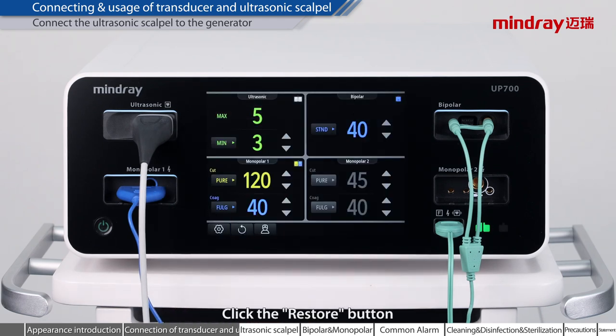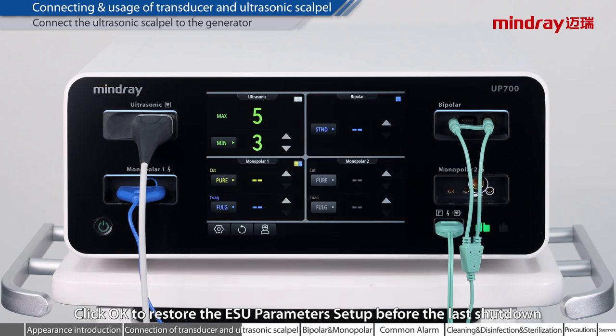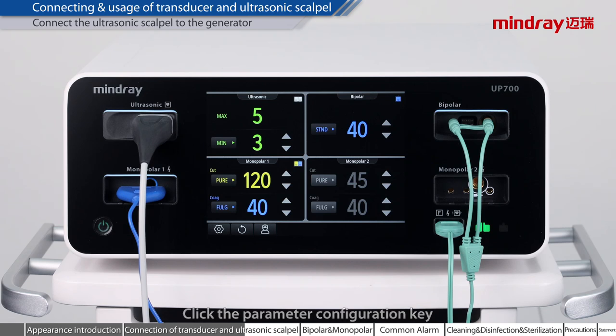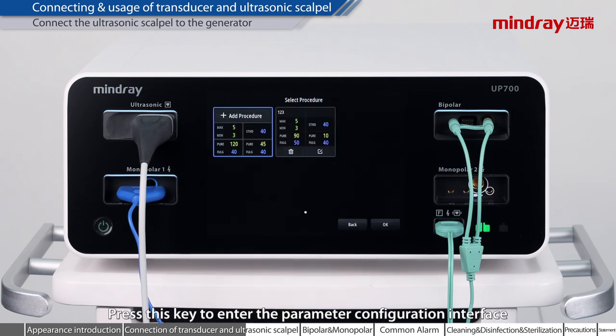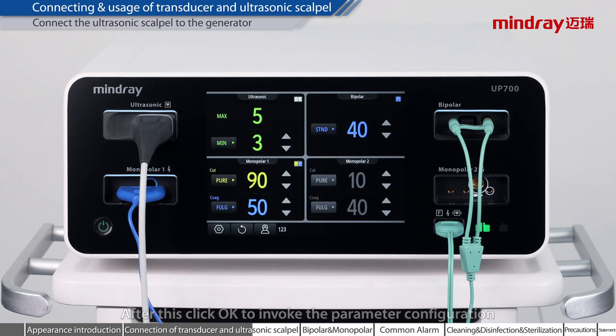Click the Restore button, then click OK to restore the ESU parameter setup before the last shutdown. Click the parameter configuration key to enter the parameter configuration interface. You can choose user-defined parameter configuration. After this, click OK to invoke the parameter configuration.